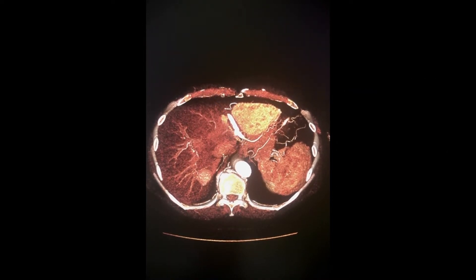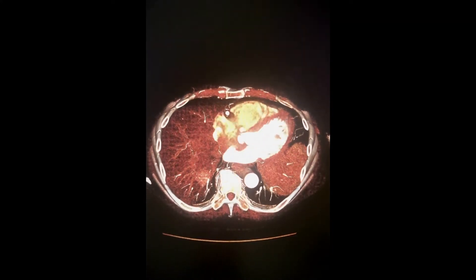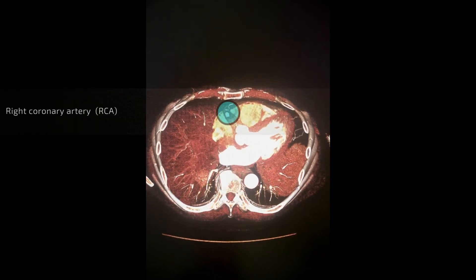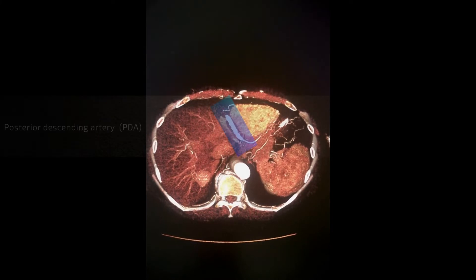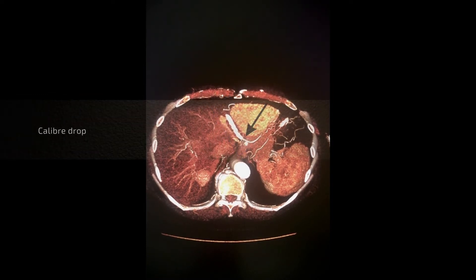This is a rendered image of the coronary vessels. This is the right coronary artery, which is quite large in caliber and extends through to the posterior descending artery. You can see that there is a caliber drop compared with the adjacent vessels.